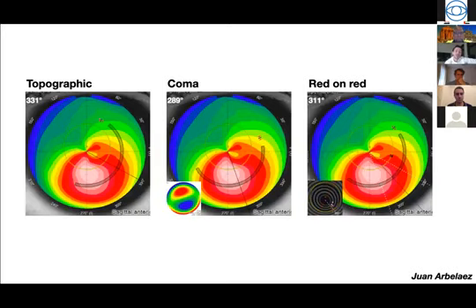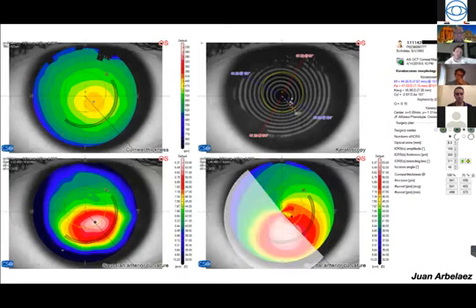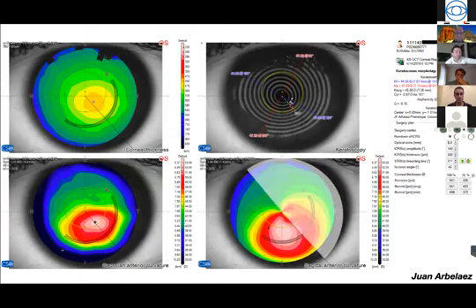Yes, there is an area that is less steep and an area that is more steep, so you will ask how you correct this. You will be flattening more than you want in one area, and perhaps flattening less than you expected in this area. So this is what I was talking about: less flattening here and more flattening here than you want.